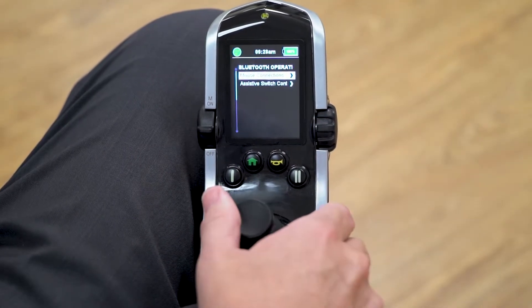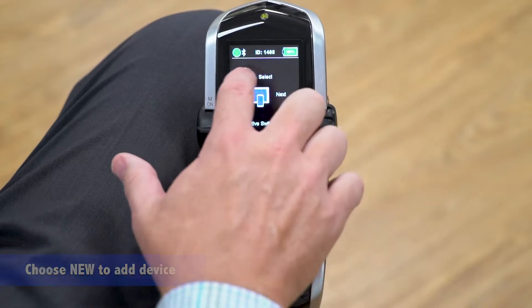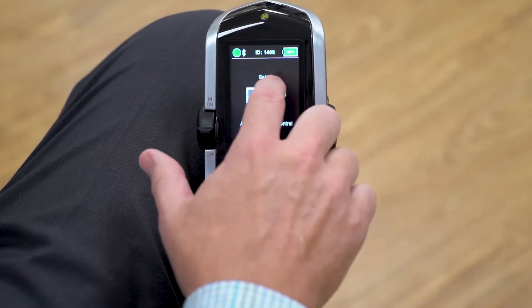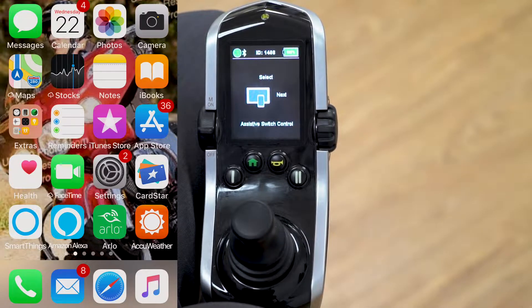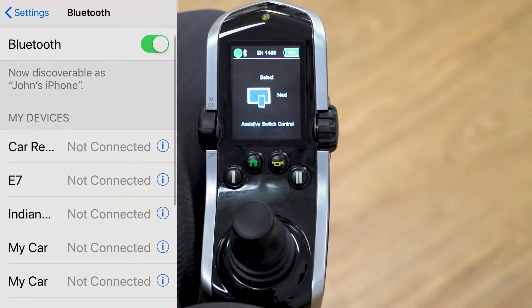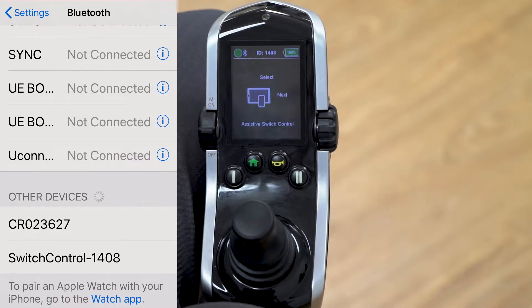Make a right command from the home screen, go to assistive switch control, and choose new because it's a new device. The Q-Logic 3 Bluetooth chip available here has the ID number 1408 and it is discoverable. Go to settings on your iPhone, navigate down to Bluetooth, and pair with switch control 1408.